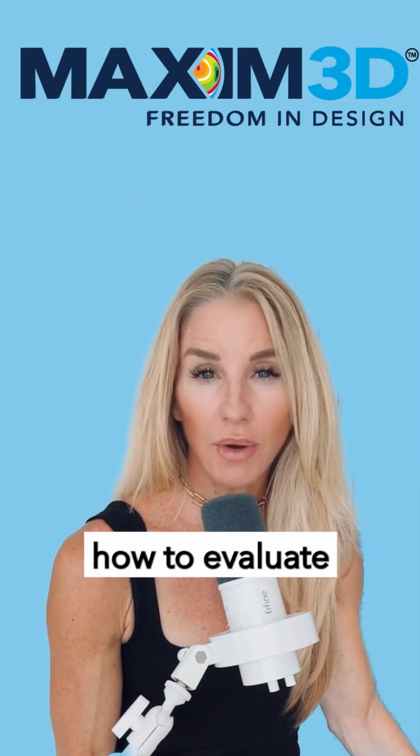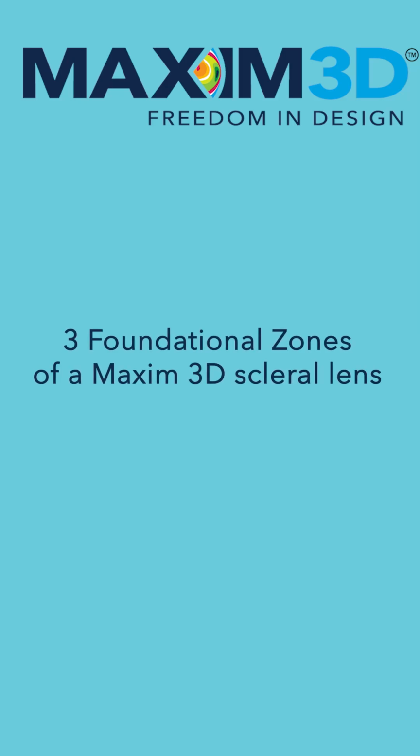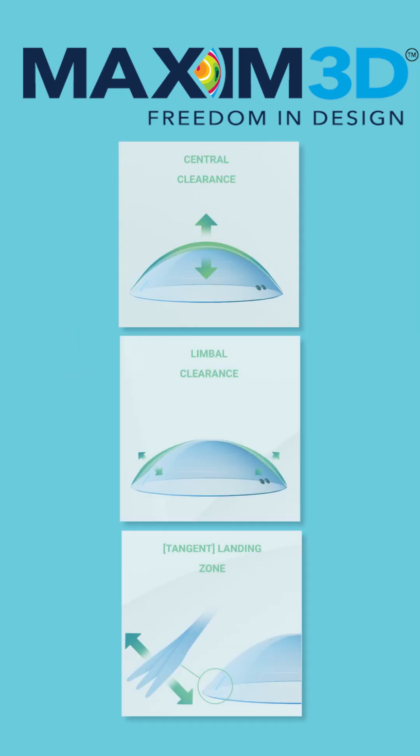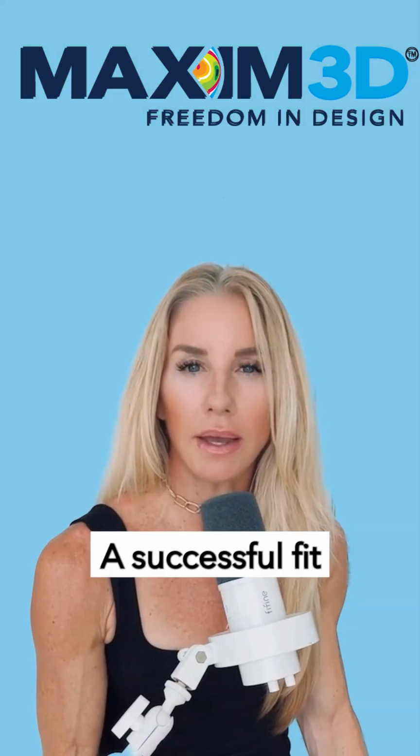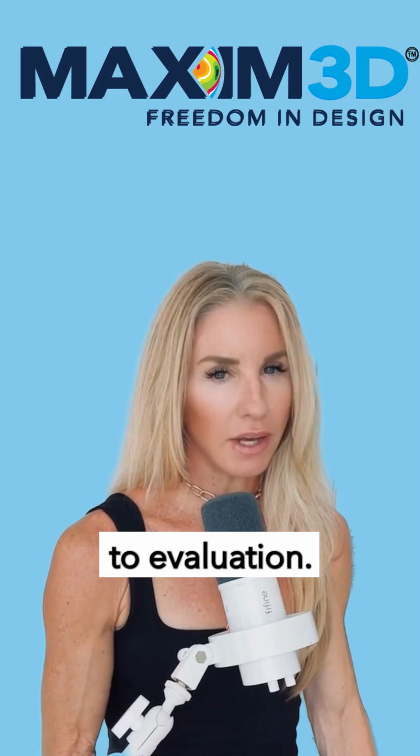Welcome to Module 4. In this session, we'll walk through how to evaluate clearance across the three foundational zones of a Maxim 3D scleral lens: the central vault, the limbal zone, and the edge or landing zone. A successful fit begins with proper setup and a systematic approach to evaluation.